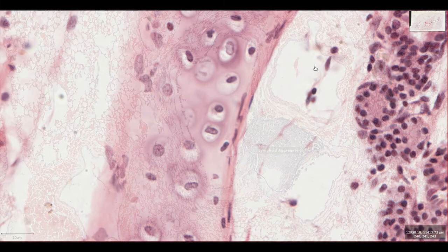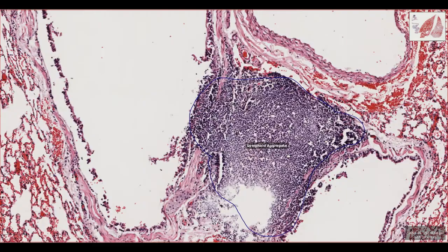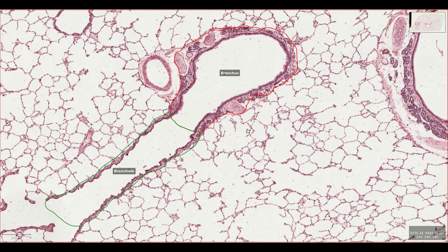Quite often there'll be lymphoid aggregates around the bronchi, like you can see in this image from a squirrel's lung. These are normal and part of the resident immune system. So if this is a bronchus, what's a bronchiole? Back in the section of cat lung there's a lovely field where we can see the transition from tertiary bronchus to bronchiole.